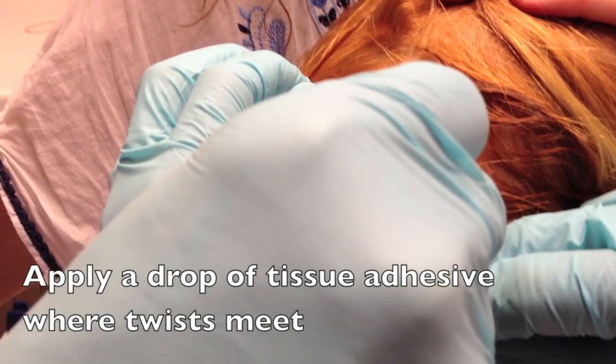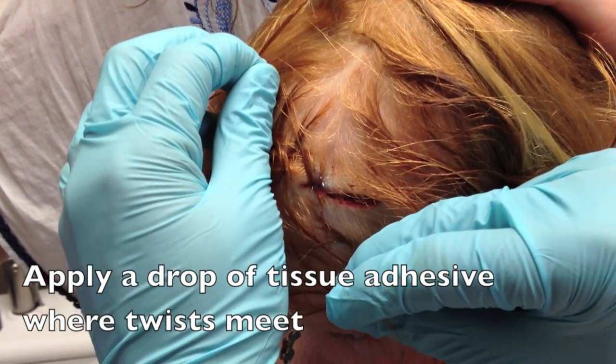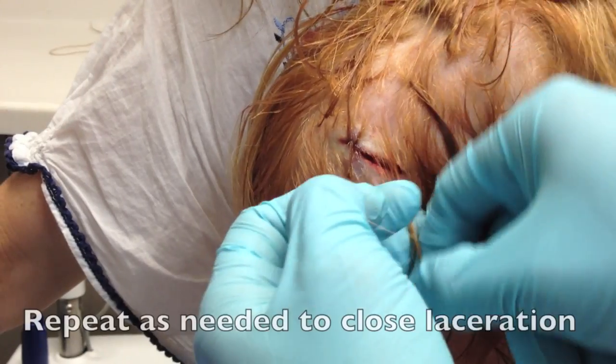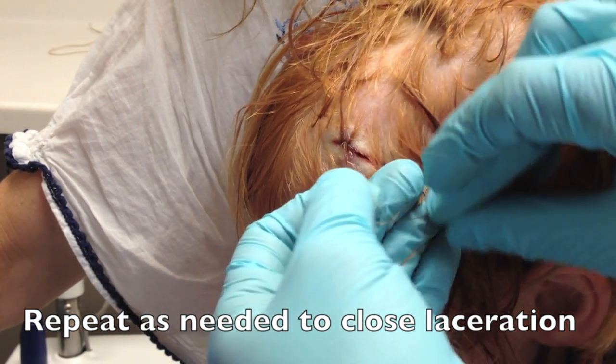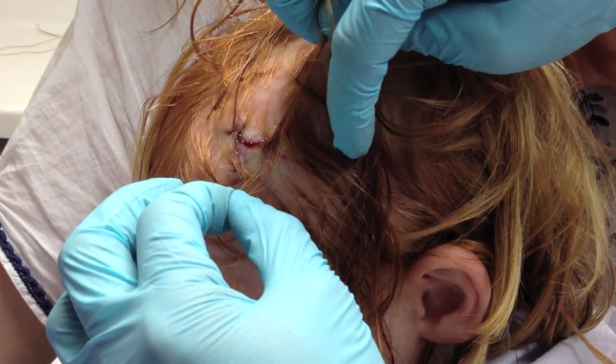Next, apply a drop of tissue adhesive right where the twists of hair meet, and hold tension there for a moment until the glue dries, which will bring the laceration edges together. You can repeat this as needed down the length of the wound in order to fully close the laceration.